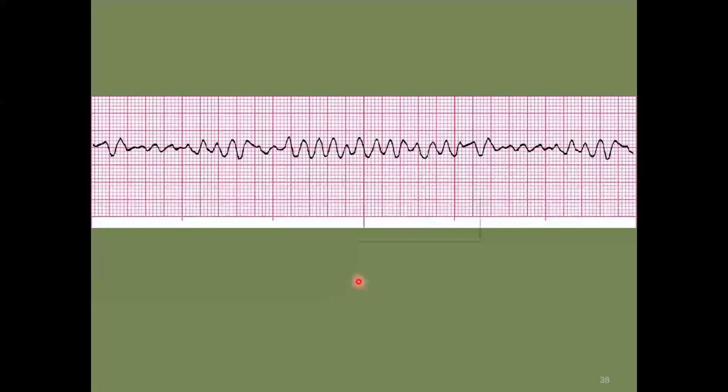Now what have we got? Also bad. Yep. I like that. You guys are nailing these. This is VFib. There is a 99.9% chance that this patient is not going to be talking to you. And if they're talking to you, then you've got a loose lead somewhere.